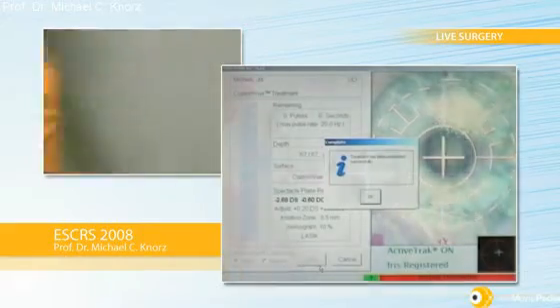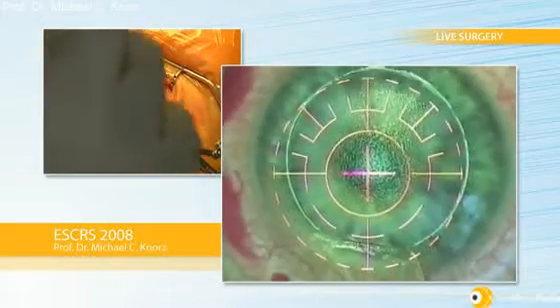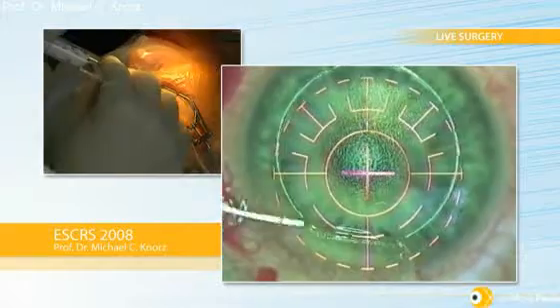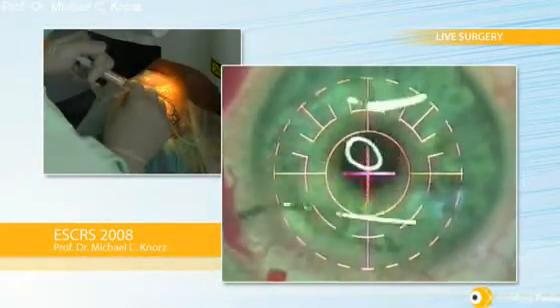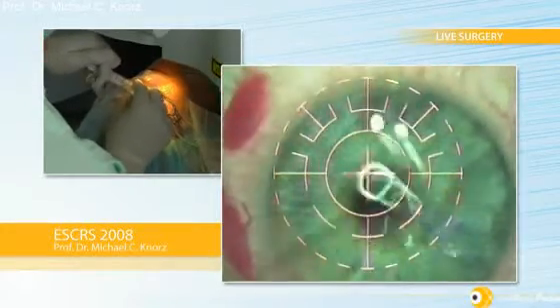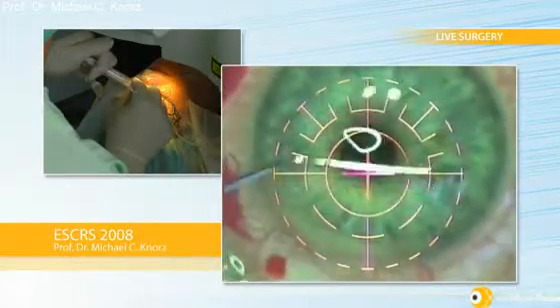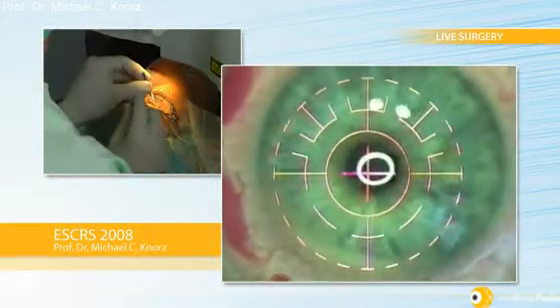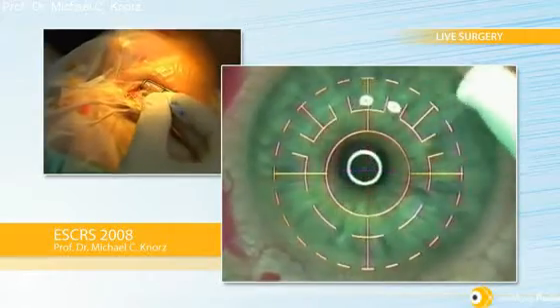Now the ablation is done. I will bring up the lights and start the coaxial light again, start the aspiration, and then unfold the flap upwards and bring it back in one smooth movement. Then I go under the flap and irrigate using a Lindstrom multiport irrigation cannula. Next I use a very smooth, very soft and wet Merocel sponge.